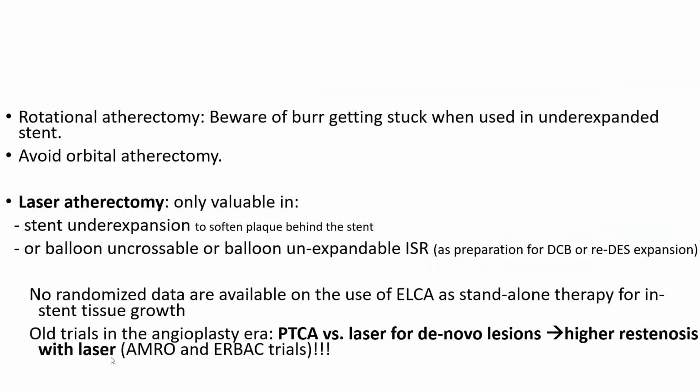In fact, in the angioplasty era, in the 90s, there were trials comparing balloon angioplasty versus laser for de novo lesions, and there was higher restenosis with laser versus balloon angioplasty. This is for de novo atherosclerosis. There is no reason to believe that laser will improve the outcomes for in-stent tissue growth compared to just balloon angioplasty. That's why I don't think it's a good standalone treatment. It's only a good treatment when you have those cases, not for in-stent tissue growth.